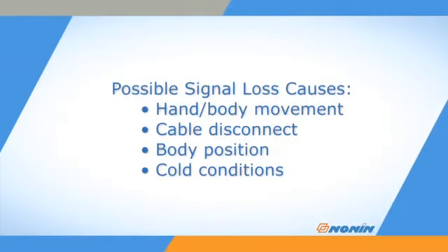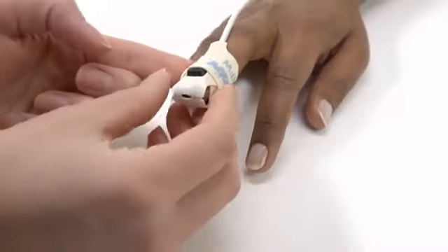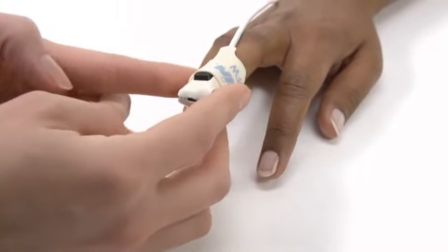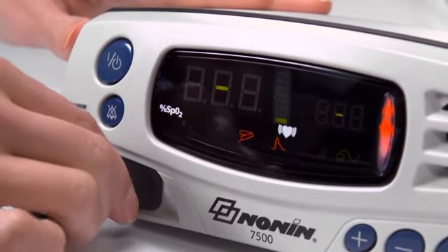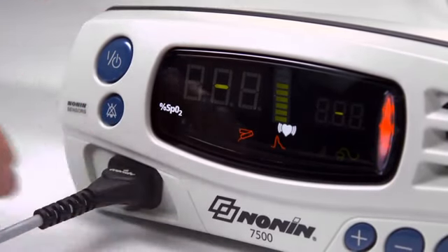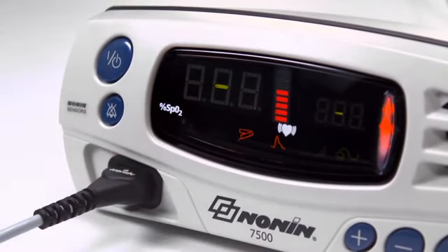Signal loss from the sensor is possible with hand or body movement or disconnection of the cable. Signal can also be reduced by body position or cold conditions, which may reduce blood flow. Check and correct the position of the sensor if it has moved, and recheck the sensor connection to the oximeter. If the sensor is in proper position, assess other causes for poor signal quality.